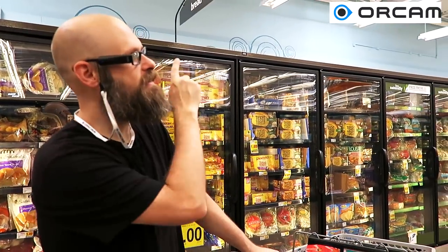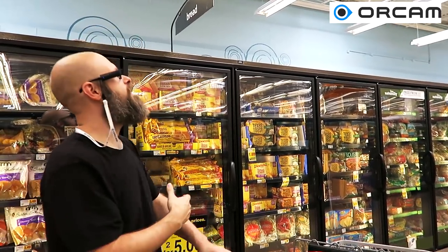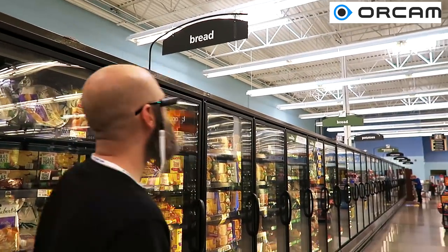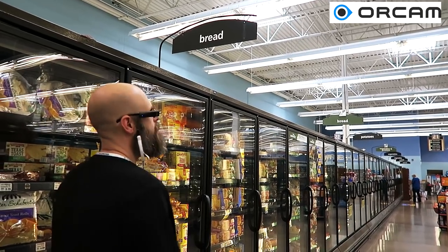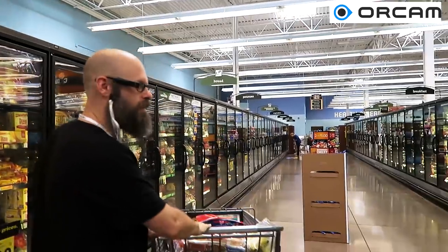One of the main issues I have in the grocery store is seeing these little signs that tell you what section you're in or what's on the aisle. So we're here in the frozen food section, we're going to try and read those. There's one right here — we'll see what it says. Bread. This must be the bread section.